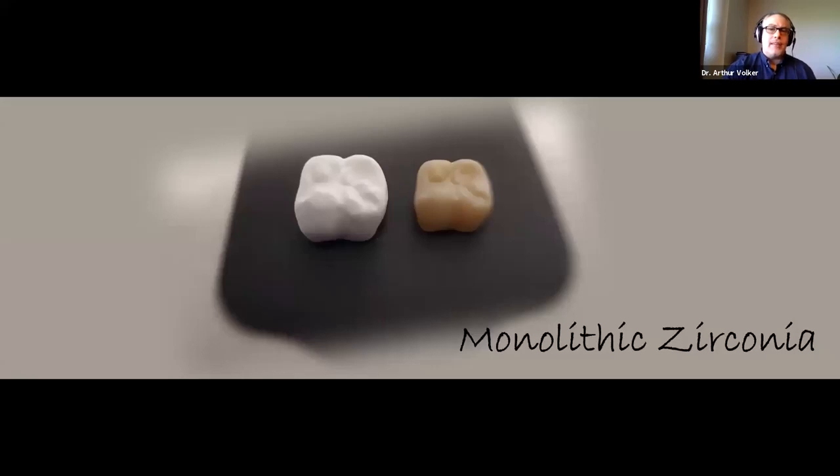Now here is what monolithic zirconia looks like. It's actually monolithic, and I should say monochromatic as well. On the left this is what it looks like as we remove it from the puck. These are identical crowns fabricated twice. The one on the left is as it comes out of the mill, and the one on the right is as it comes out of the sintering oven. And you'll notice, of course, very obviously, that during sintering, there is a volumetric shrinkage of the material, and that's where it provides its strength.